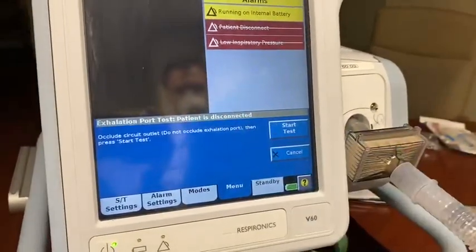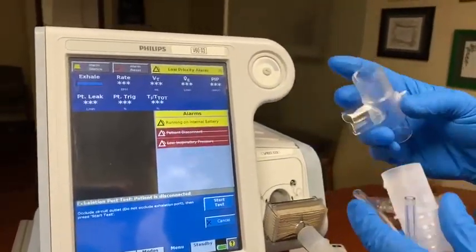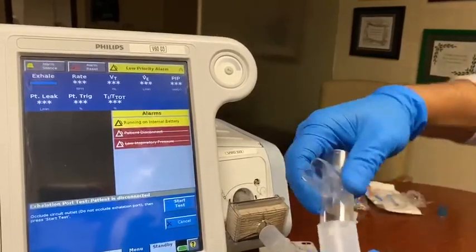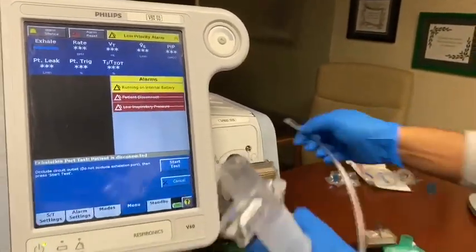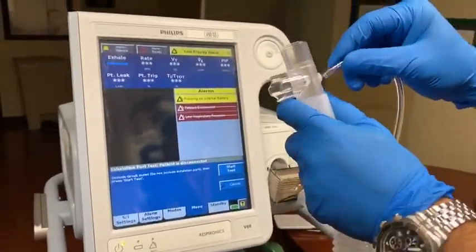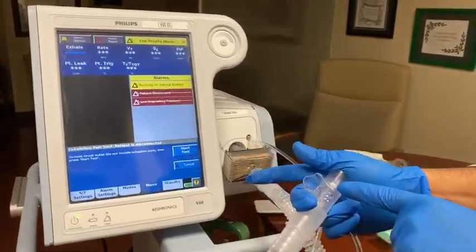And now you will be asked to do a circuit check. Disconnect the patient. All you need right now would be a T-piece adapter that will enable your conventional circuit to be used for invasive purposes. You attach the circuit, you attach your pressure line, the other end to the pressure port. Occlude the circuit, leaving the exhalation valve open.